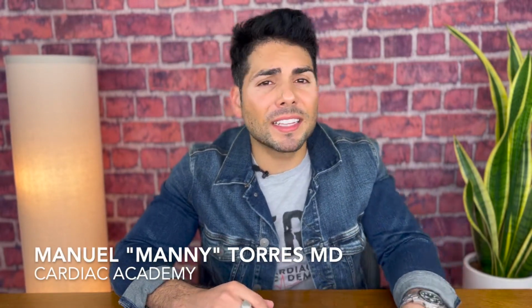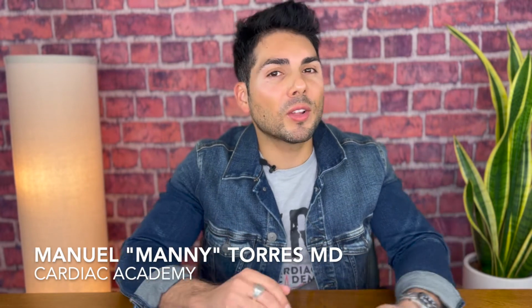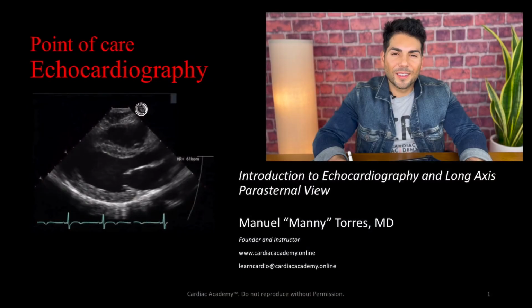In this video, we're gonna dive into our very first point of care echocardiography video. So today is all about the Parasternal Long Axis View. So buckle up because we're going for a ride. Okay, let's get started.